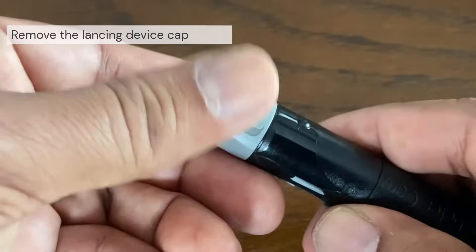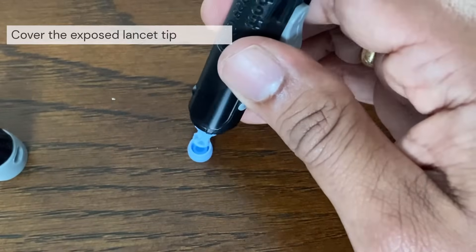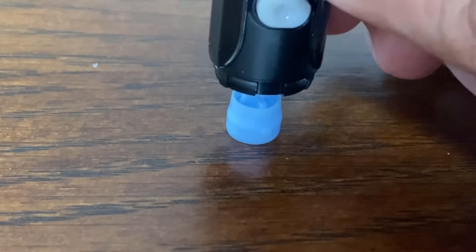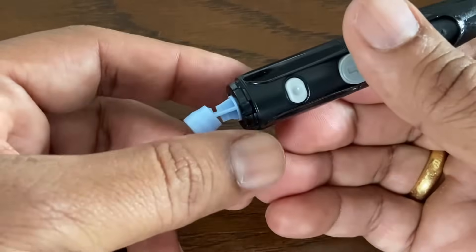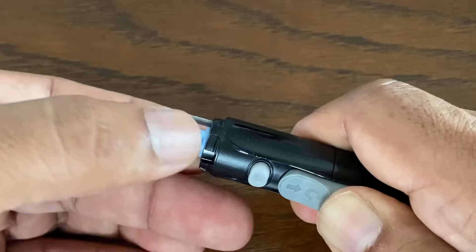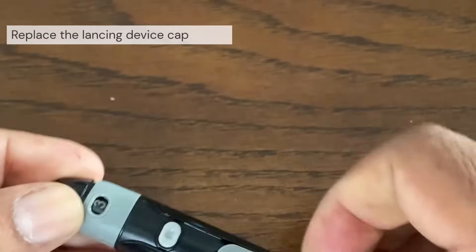Remove the cap from the lancing device. Before removing the lancet, place the lancet protective cover on a hard surface, then push the lancet tip into the flat side of the disc. Holding the lancing device directed downwards, push the slider forward until the lancet comes out of the lancing device. Place the cap back onto the device.